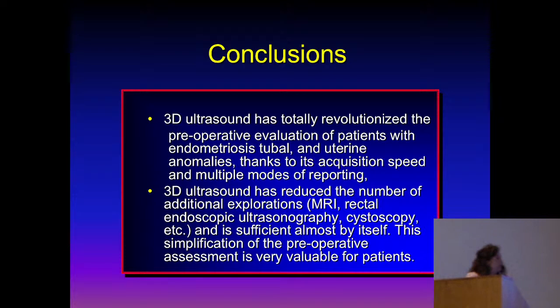And we rarely require MRIs. Just based on the study, if a patient has more than 6 or 7 fibroids, the MRI seems to give a little better picture for preoperative evaluation, to decide if it should be an open case versus a laparoscopic case, and really map them all. But the importance is to be able to counsel the patients ahead of time.